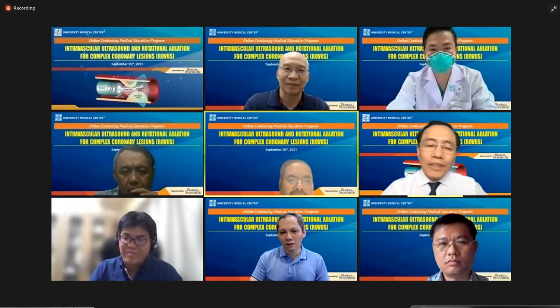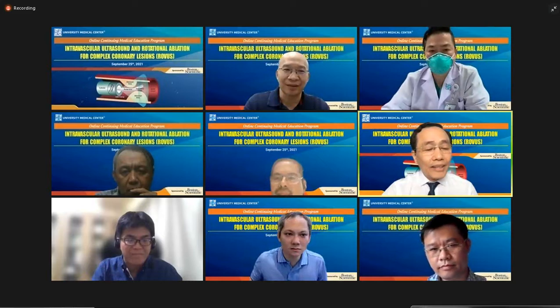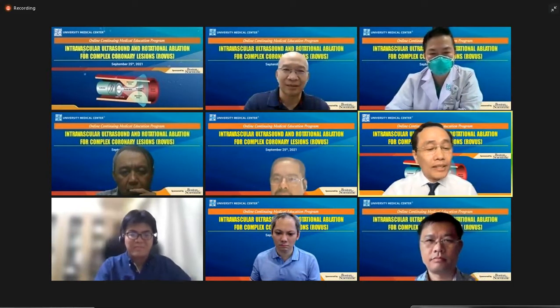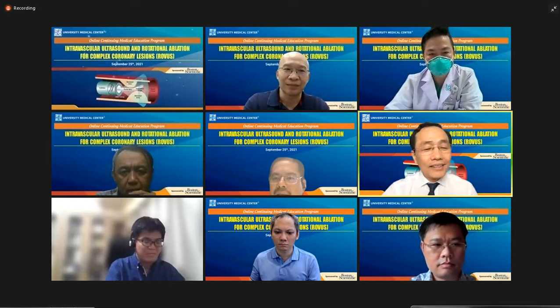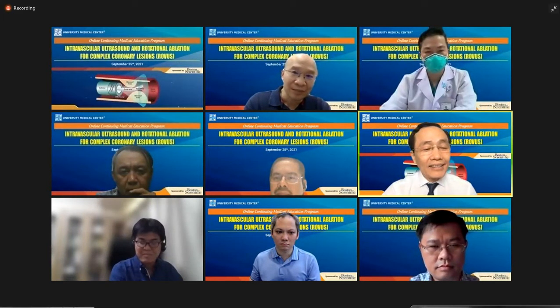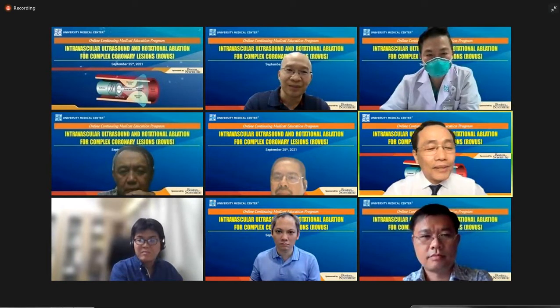Thank you, Dr. Quang. So the live case is already on the table. We will just listen to Professor Nguyễn Văn Tân's voice. How about your comment on the case? And after Dr. Tân, we will go to the live case.